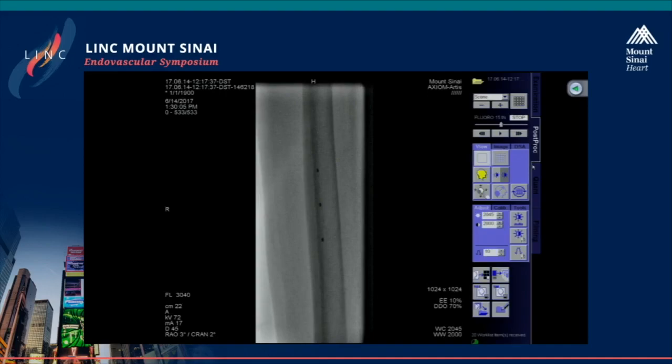But our plan would be, as you can see, we put an 018 Trailblazer. We don't have the Cook pedal sheath. So we're hoping that we can actually traverse from down below. And if we can't traverse from down below, I'm hopeful that we can traverse from below and above and maybe do a CART or a reverse CART technique to be able to break through the dissection planes.